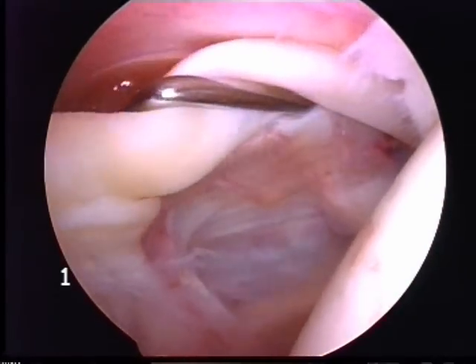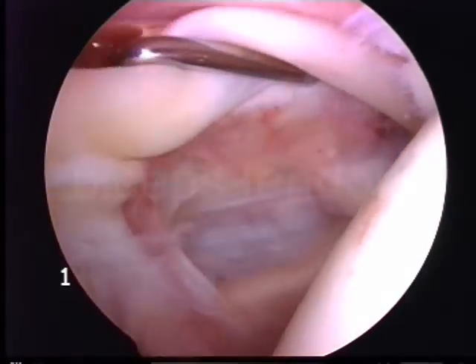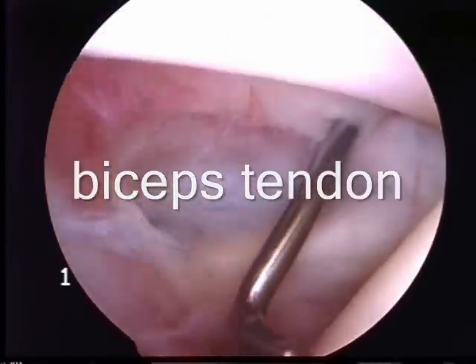The probe is now showing the biceps tendon — the long head of the biceps — which inserts at the top of the glenoid.